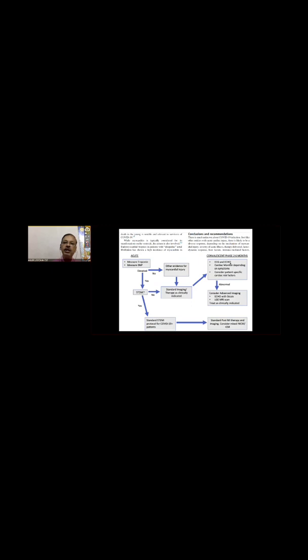See, here one thing I must say. The bullseye gives you an absolute initial impression. When you see the bullseye, you will find that this is probably the type of patient I am dealing with. Suppose there is apical sparing, so it could be amyloidosis. Then ultimately we go to the strain curves. But strain curves are very important in ischemic heart disease, where the bullseye may not be so helpful.